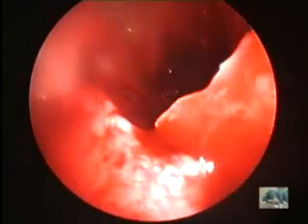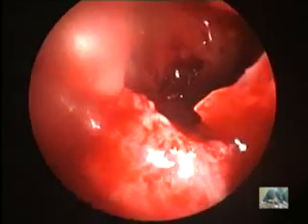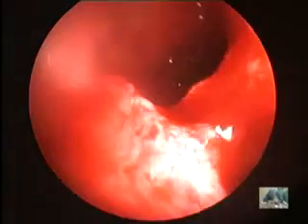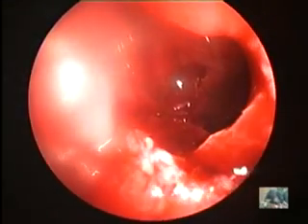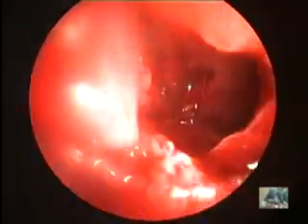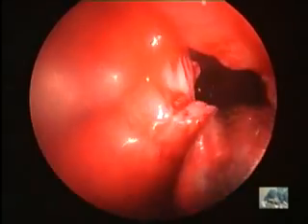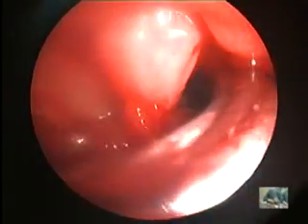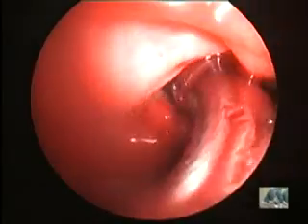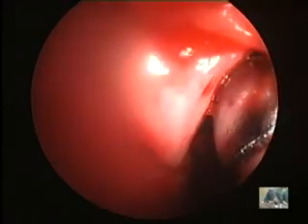And you can see that it makes that maxillary sinus look a lot smaller if the bony fragments are pushed in towards the maxillary sinus. While you can see now the maxillary sinus is looking a lot larger than it looked before we pulled these bony fragments out. Because I personally prefer to do the anterior canine fossa approach, because you don't get these bony fragments pushed in to the same extent as you do through the inferior meatus.